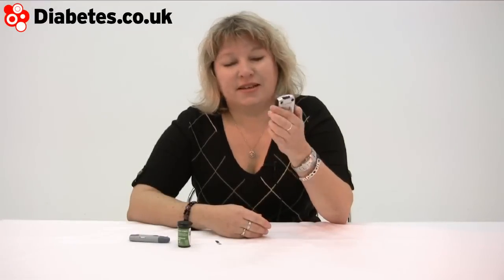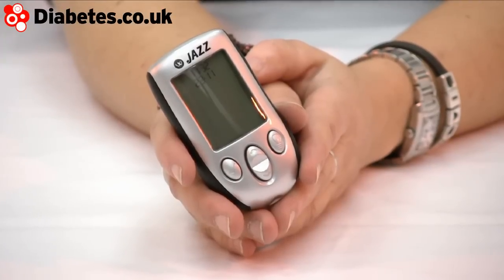This little machine is called the Jazz and the company that's brought it out is WaveSense.